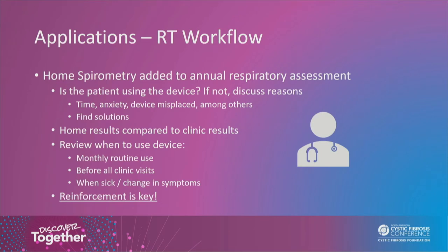Something we felt strongly about was incorporating home spirometry into the RT workflow. Home spirometry is now discussed in every annual assessment. We discuss the patient's use of the device in depth. If they're not using the device, we discuss why not. Some of the reasons given are lack of time, anxiety about test results, and misplaced devices. Once we've worked through the reason for not using the device, we then try to find solutions.